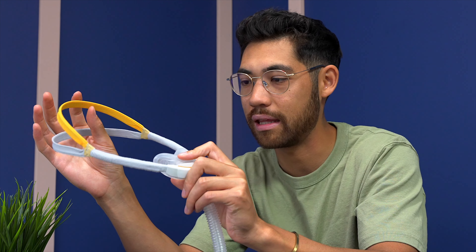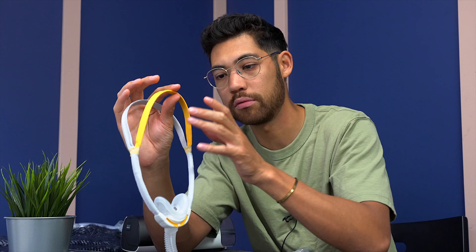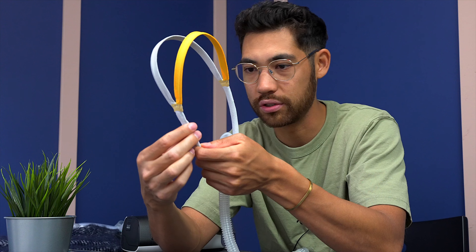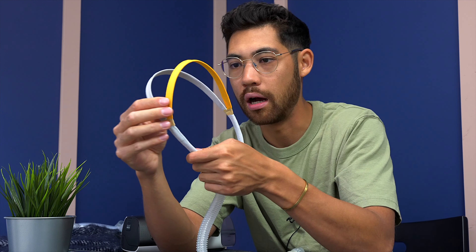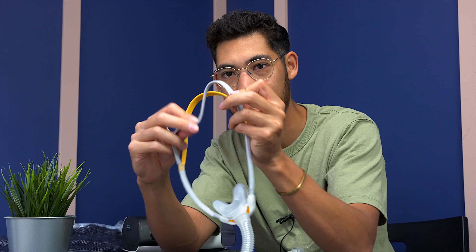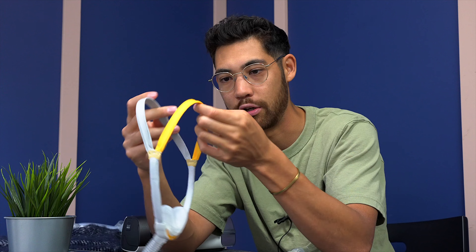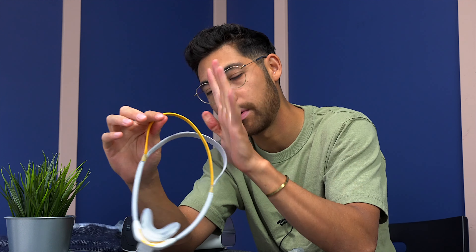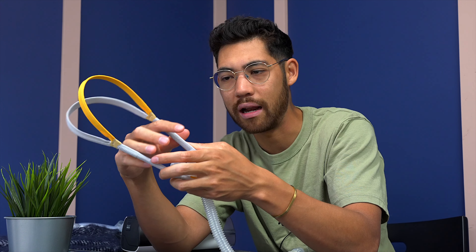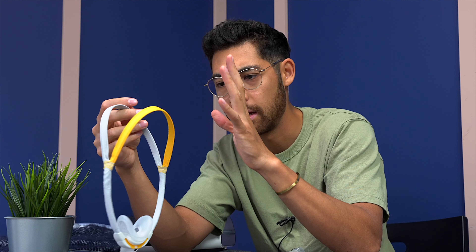Talking about the Solo first, let's look at the headgear. The headgear of the Solo in terms of build quality is excellent. It has a very nice weave — almost feels like a knit sock — similar to the P10. But the back of it has wires or a plastic frame to give more rigidity in the back of the headgear. It has a little more structured feel. It's not stretchy back there, but that's not an issue because of the front. Even though the backing is a little stiffer, it works pretty well.